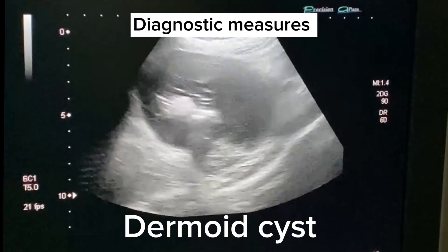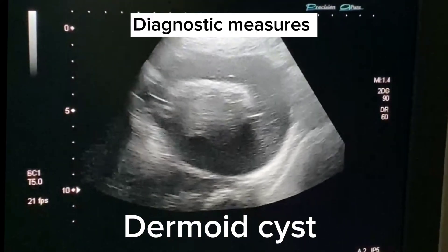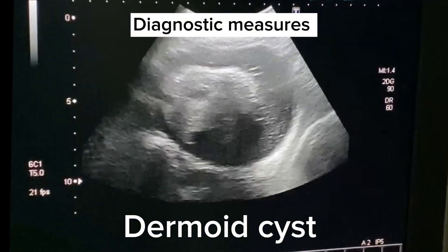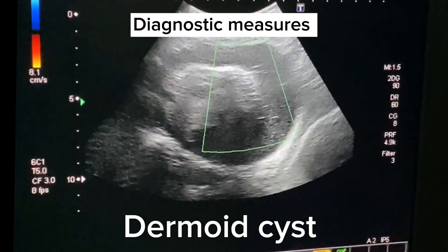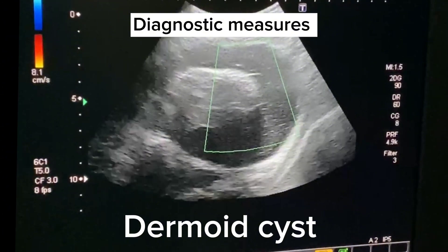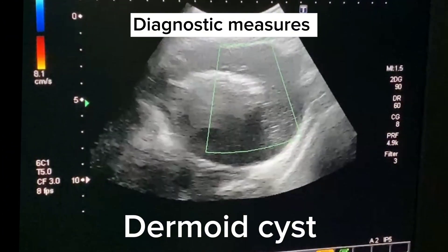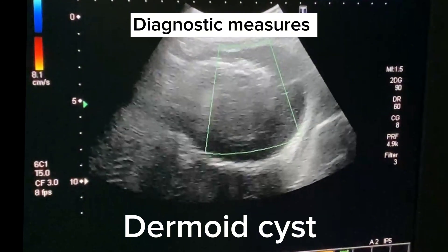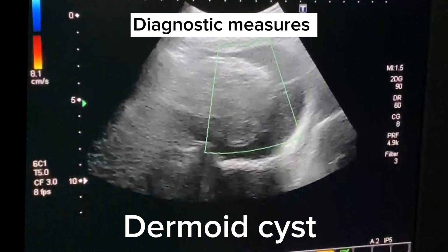Ultrasound is the key method to diagnose dermoid cysts. It is seen as a complex mass with echogenic areas, fat-fluid levels, or calcifications.